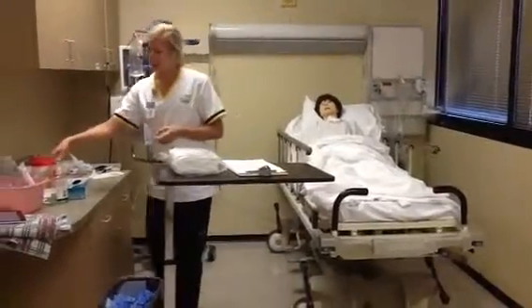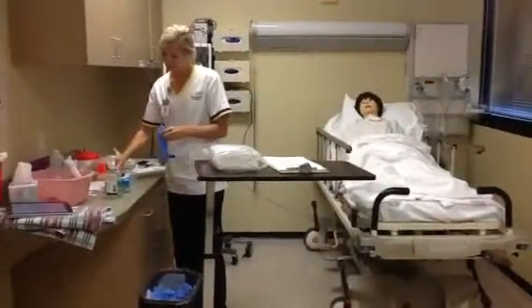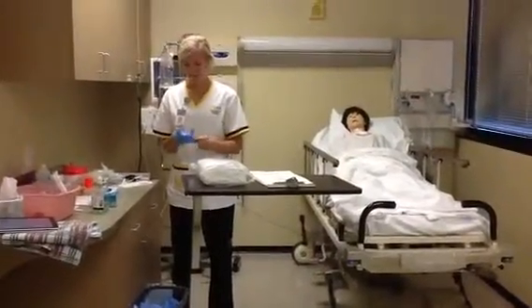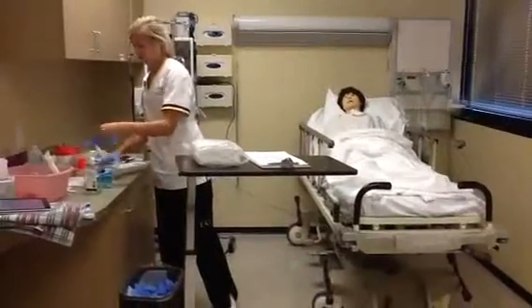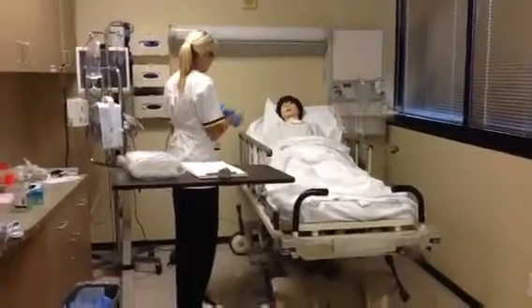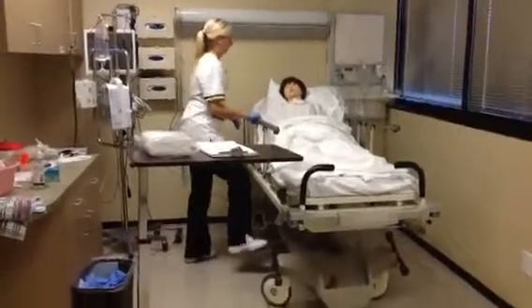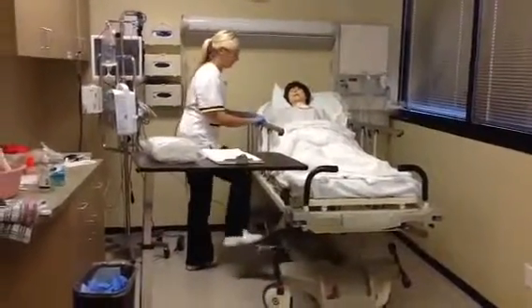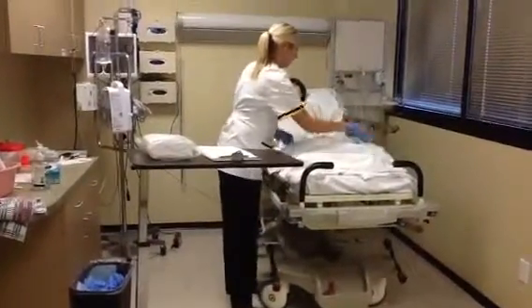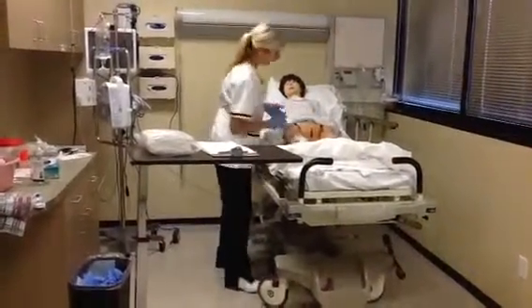So I'm going to perform hand hygiene and put some gloves on to assess the area. Okay, and I'm going to put the height of the bed up right now. That makes it a little bit easier. And put the rail down. And lift up her gown. And to assess, I'm going to visualize the urinary meatus.